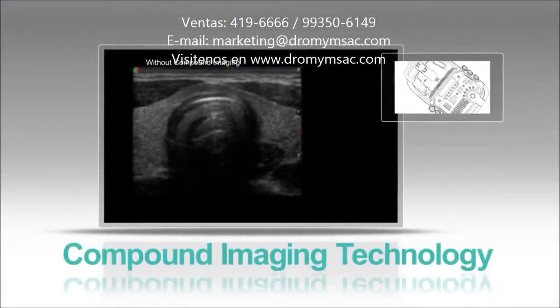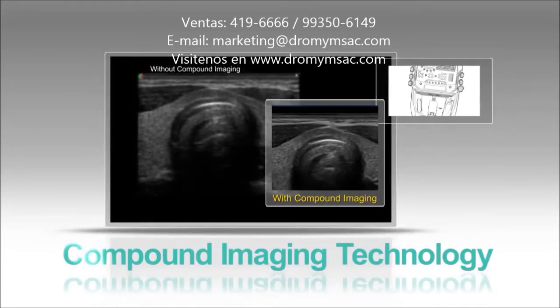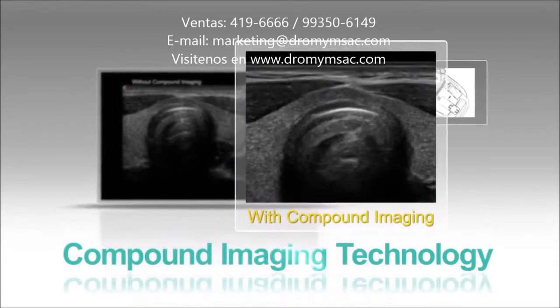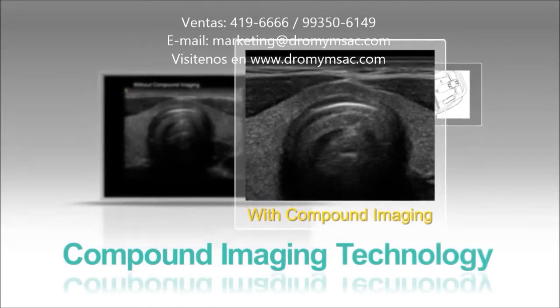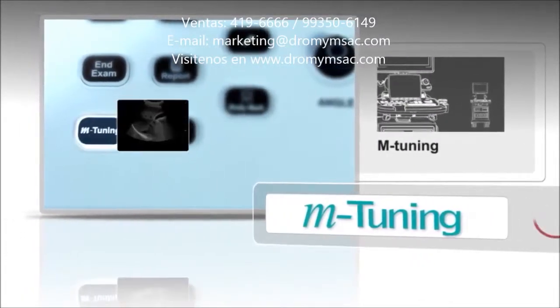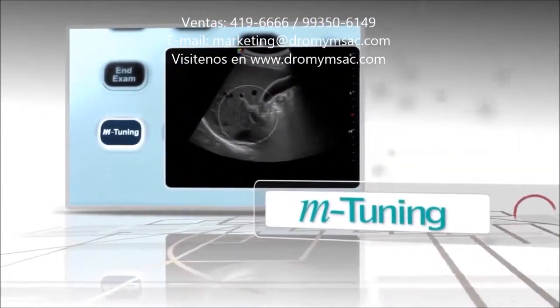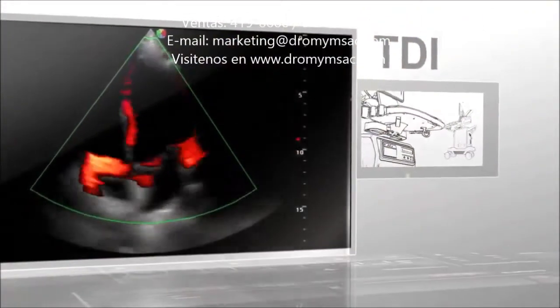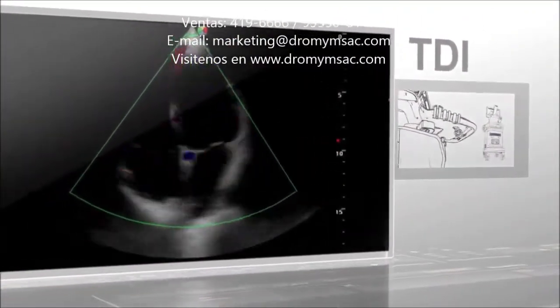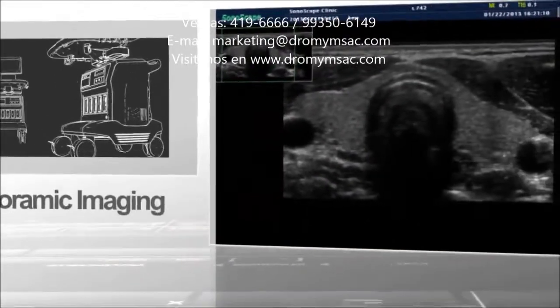Compounding imaging technology enables the doctor to look at the same topographic view of the human body from multiple directions, resulting in improved continuity of structures and reduction of speckles. M-tuning — just one key and parameters will be optimized automatically, shortening examination time and ensuring optimal results and accurate diagnosis. TDI technology can enhance the frame rate, reducing eye fatigue and guaranteeing the stability of the image.